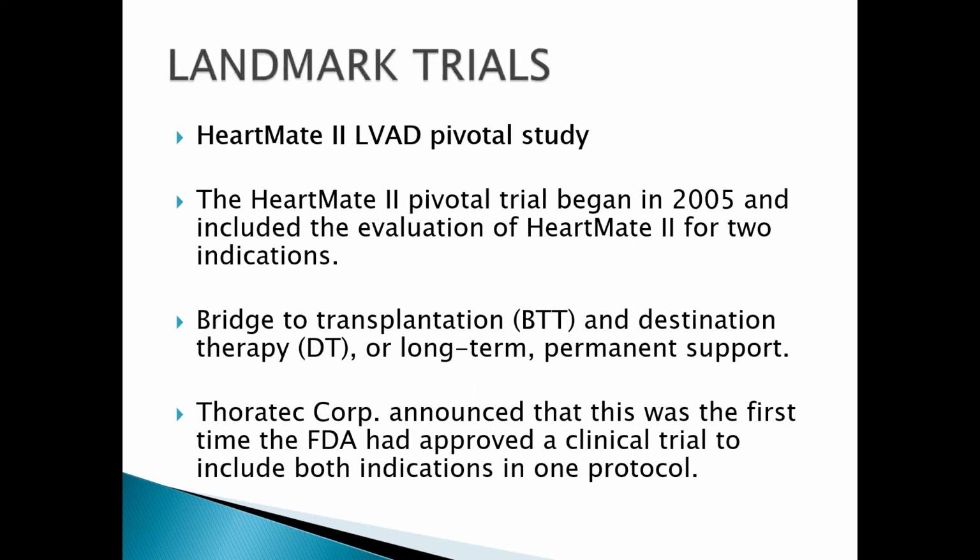So what are the landmark trials in ventricular assist device study? One of the trials that was done is the HeartMate 2 left ventricular assist pivotal study. It began in 2005 and included the evaluation of the HeartMate, one of the ventricular assist devices being used right now. They considered it for two indications: for use as a bridge to transplantation and also as destination therapy, or long-term permanent support.